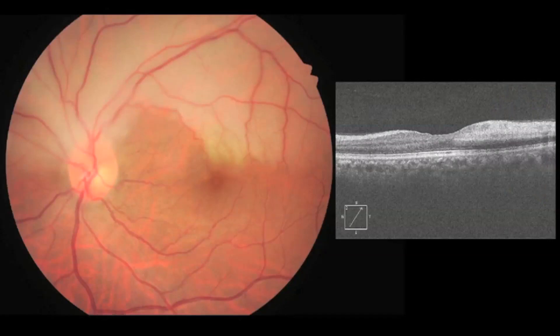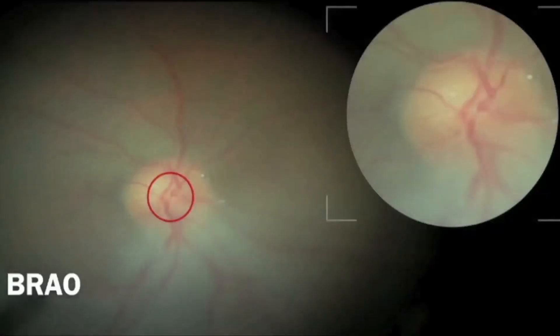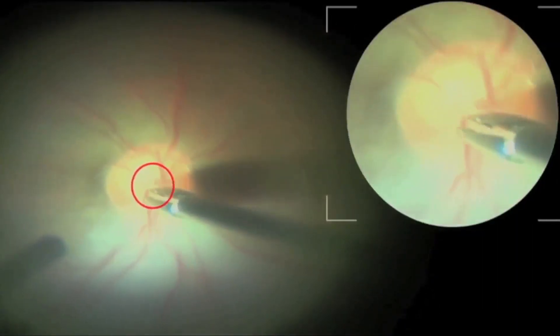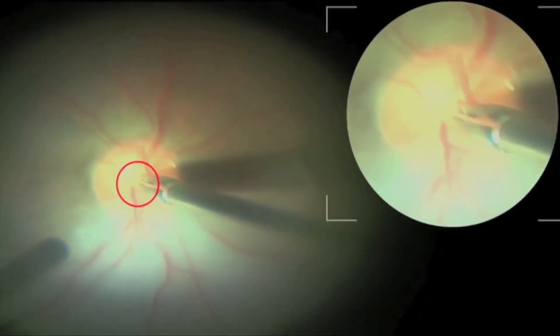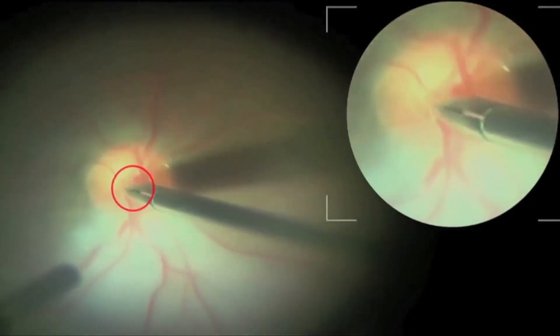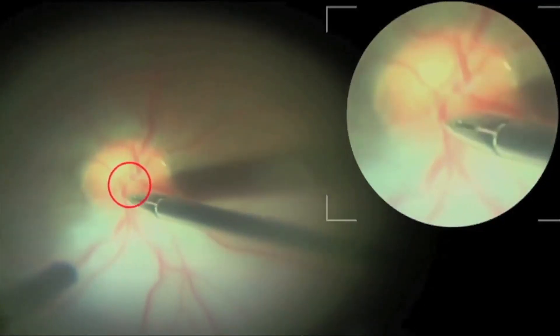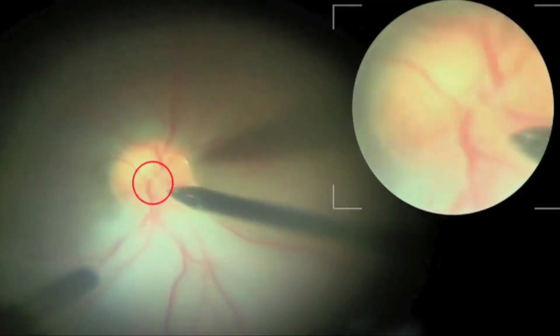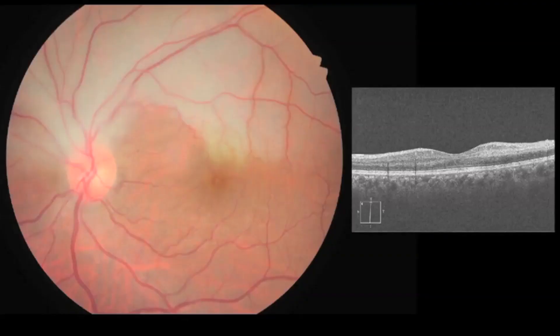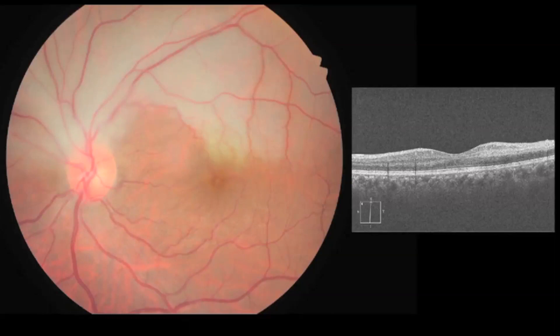This procedure also helps in branch retinal artery occlusion. Here we can see the thrombus being dislodged in an eye with progressive visual loss following a branch retinal artery occlusion. He went on to recover 20/20 vision by the 5th post-operative day.